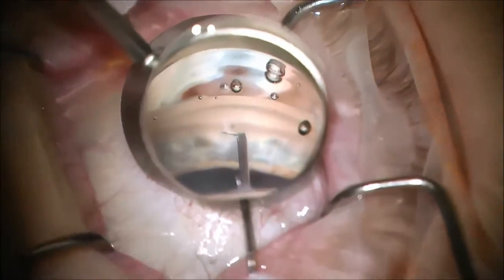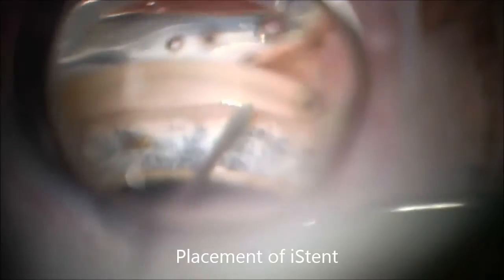The tip of the iStent is moved across the anterior chamber to the angle, where it then gently pierces through the trabecular meshwork and is glided into the correct position into Schlemm's Canal.